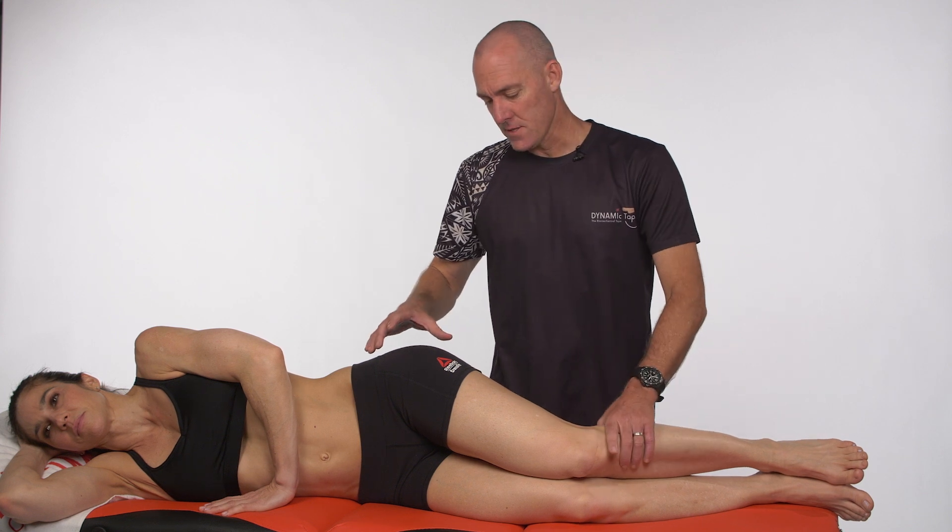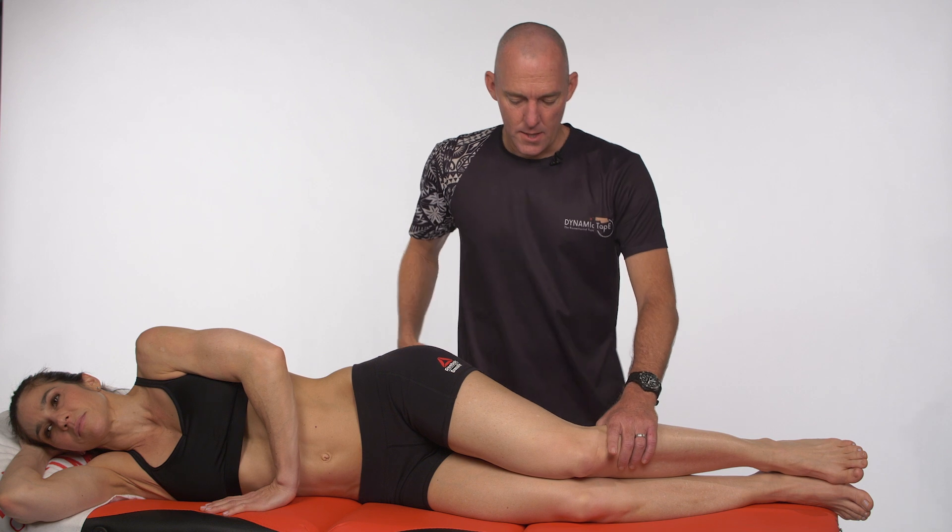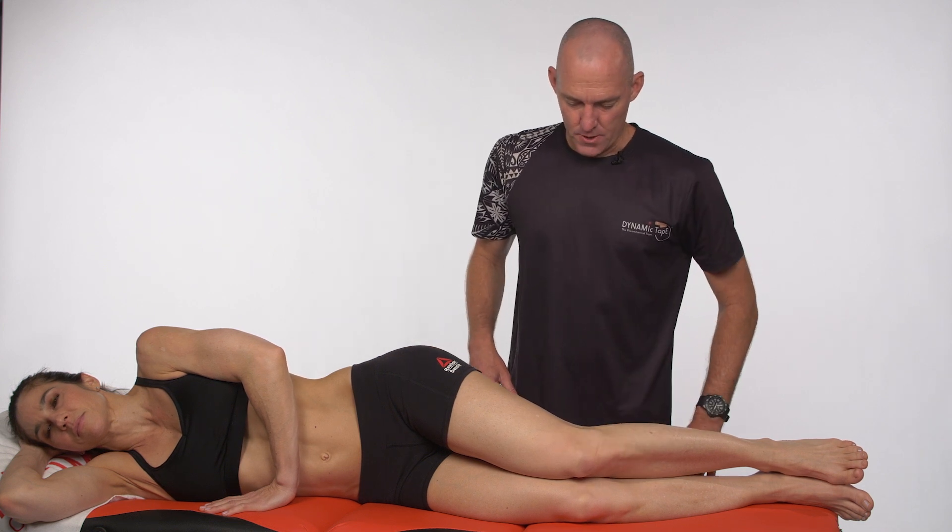The main part is to get hold of this lever crossing the hip joint as well, so we're controlling this lateral pelvic motion at the same time.